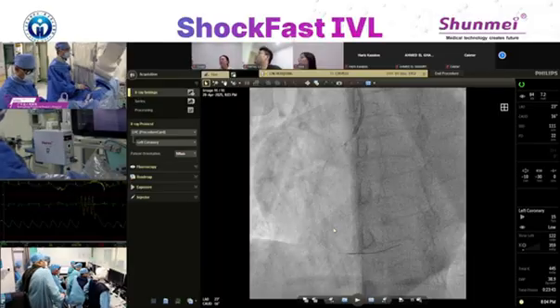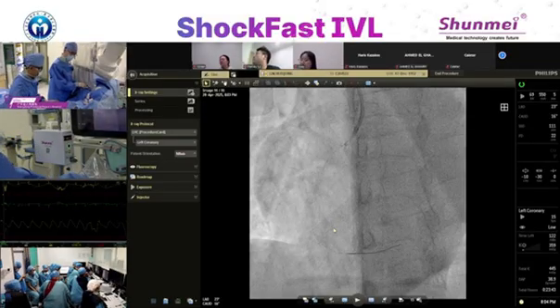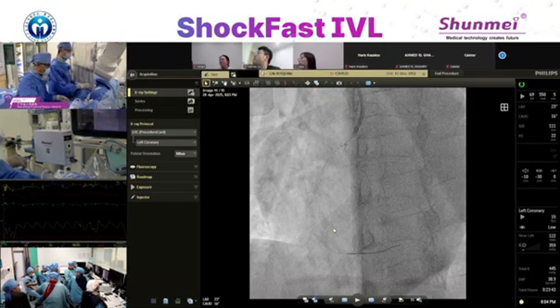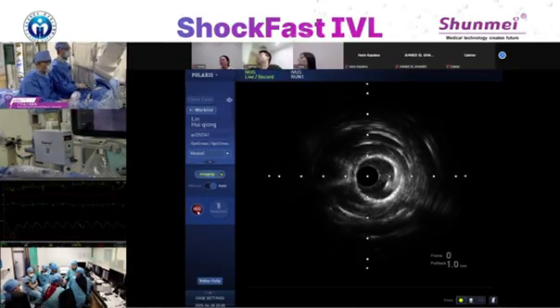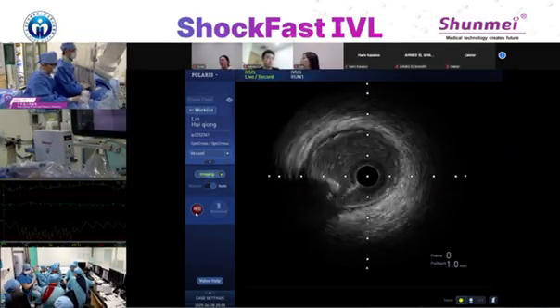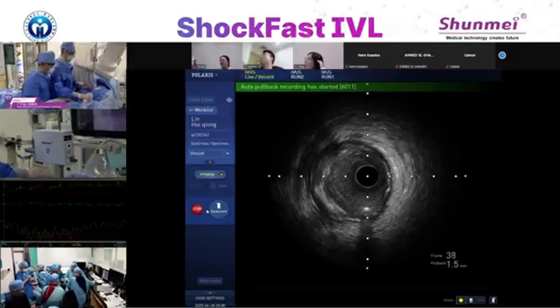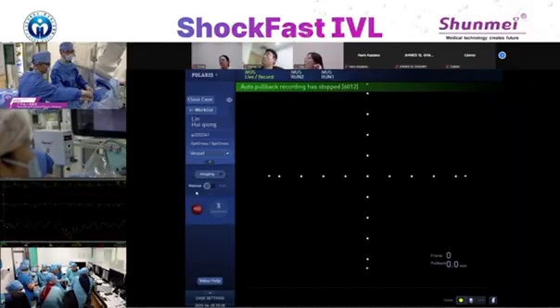Because there is some eccentric calcification over there. Wait, no need for me to do it manually, I'll manually pull back to identify.